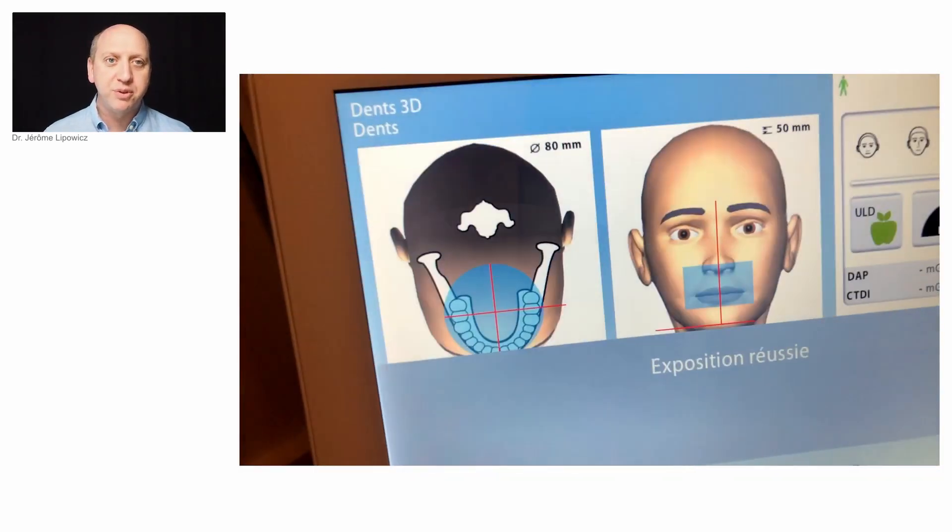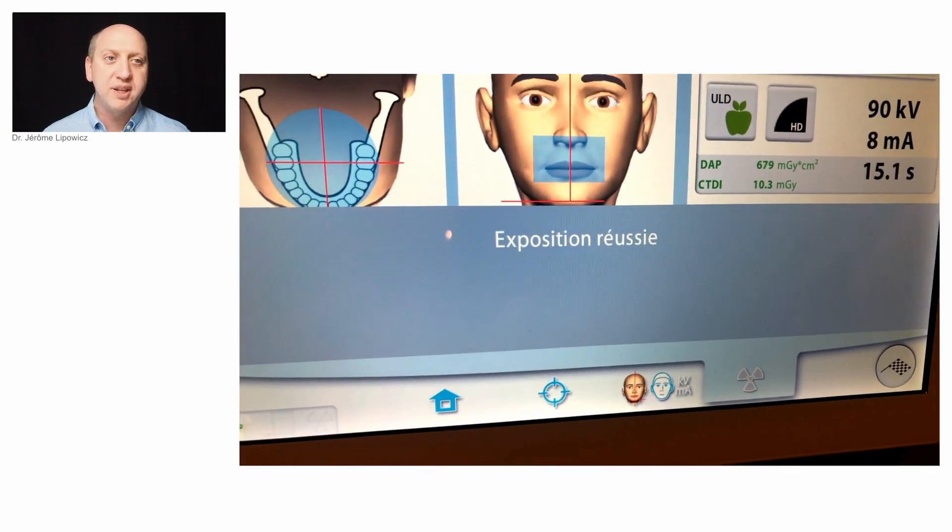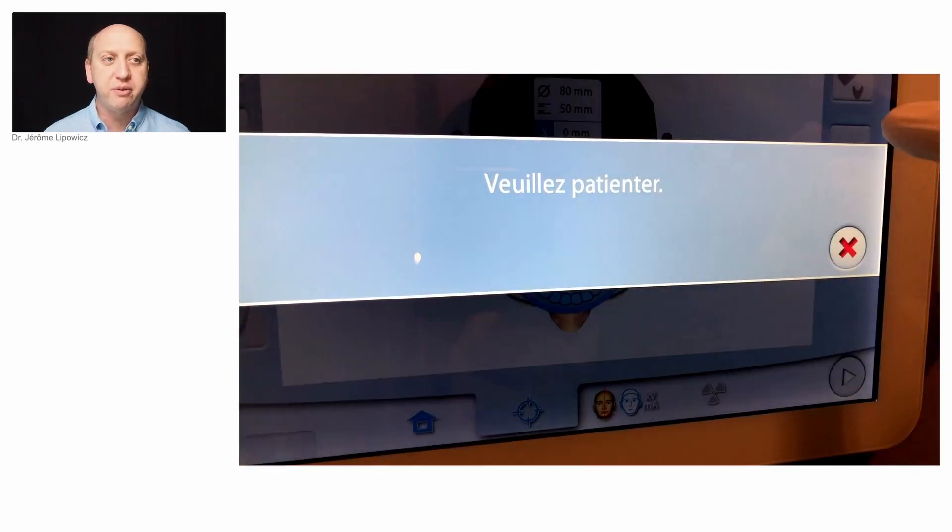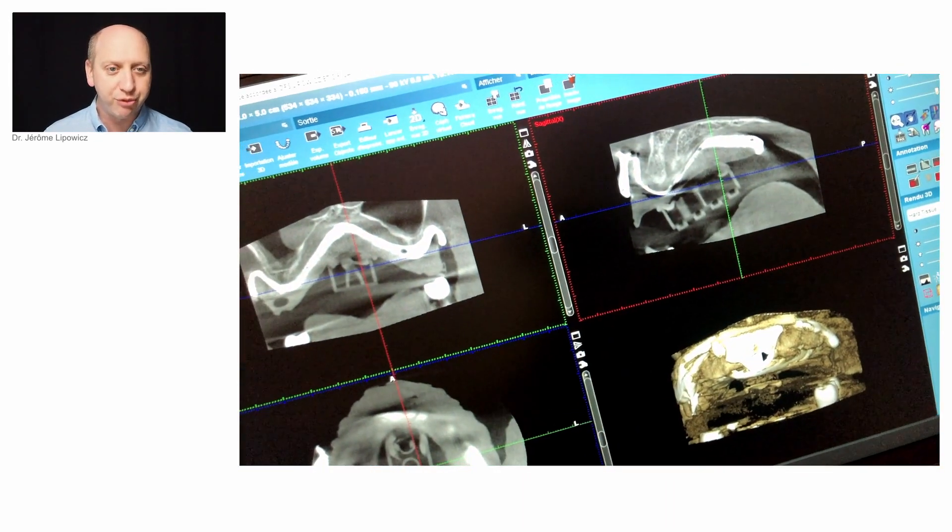And this moment is very interesting because with no effort we get a fiduciary marker that is very easy to read on the cone beam CT with a simple Lego brick.